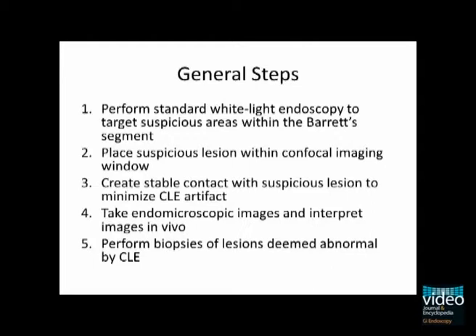Once a stable position is achieved, endomicroscopic images are obtained and interpreted in vivo. The final step of the procedure is biopsy sampling from lesions that are deemed abnormal.